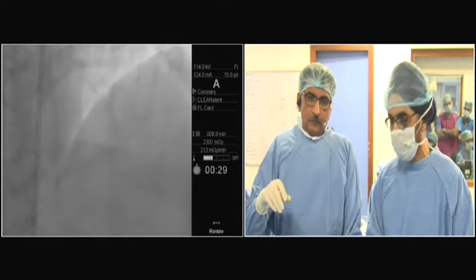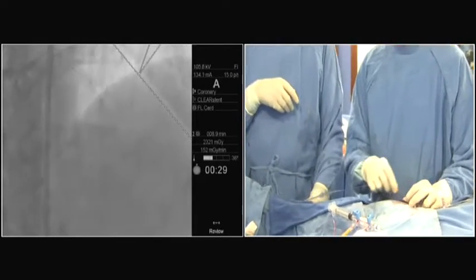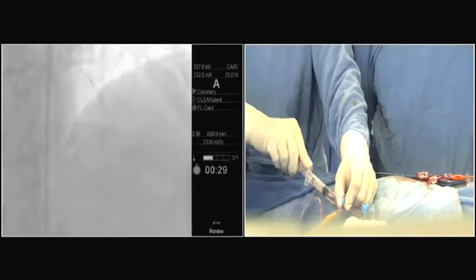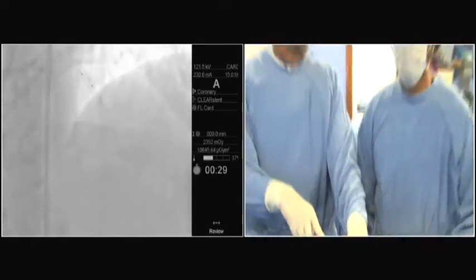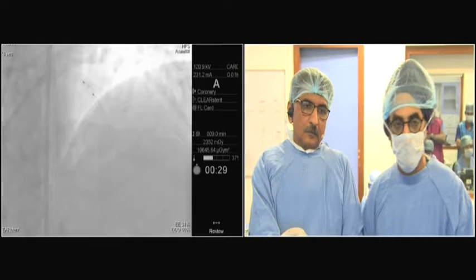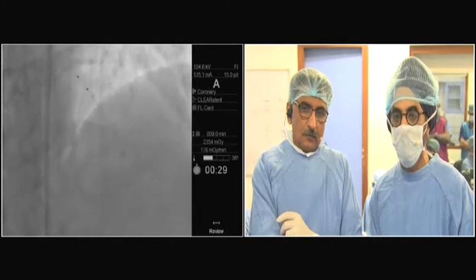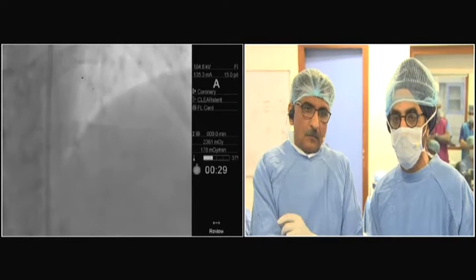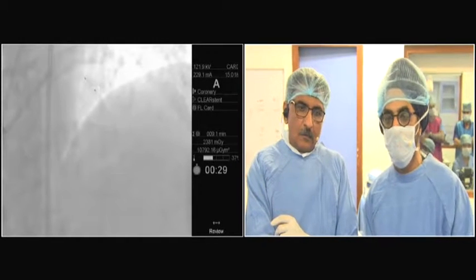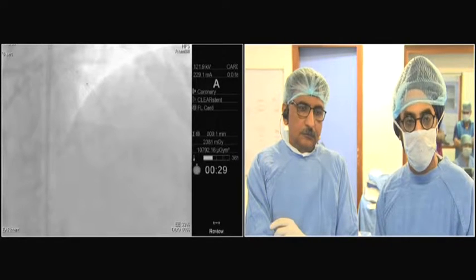If you use the crush technique quite often, do you sometimes use the DK crush to help facilitate crossing again? Or do you usually do the single step crush? I elected to use a single stent crush in this patient, looking at the calcium, which might impede me getting another stent or the balloons or doing the kissing repeatedly. That's why I saw the calcium on IVUS, and I was prepared for a rota also, but my reason to use a single crush was to avoid difficulties in pushing stents later on.